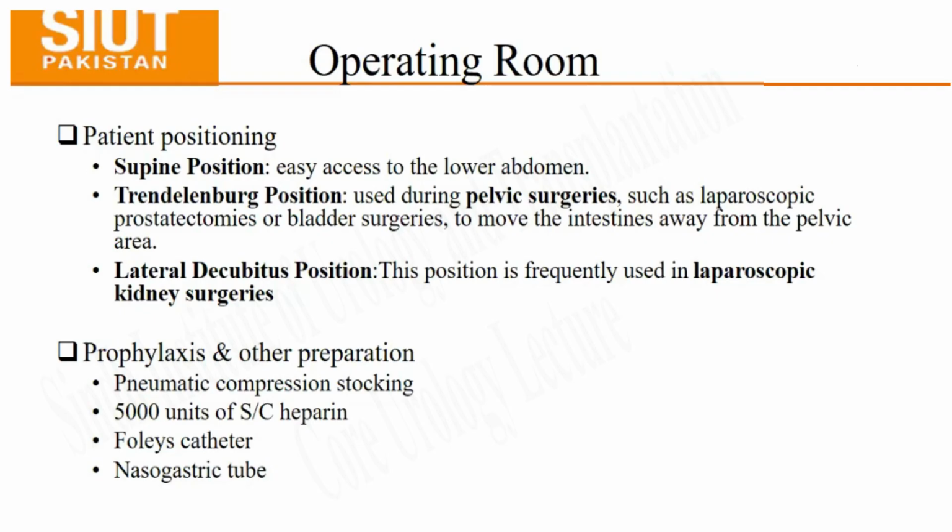So all those things which were contraindicated previously, now they are just doing. For instance, in CABG, instead of a graft from the saphenous vein, you can use the internal mammary artery for the same purpose, so you don't have to open up the chest. This was done earlier by laparoscopy, and nowadays by cardiothoracic surgeons on the robot. Even in thyroid surgeries, they are placing the ports in the armpit and chest so that your neck remains clear, and you have a scarless neck. So a lot of things which were contraindicated are now not contraindicated. Things are improving at a very fast pace.